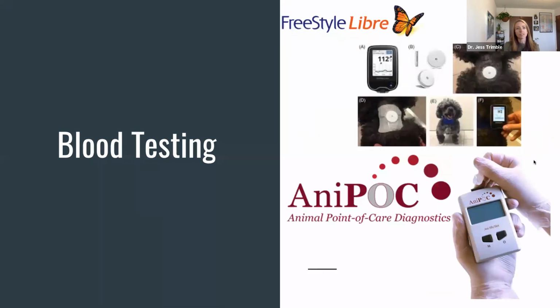A little bit more on blood testing, more on the specific side. If you haven't heard about the Freestyle Libres being used in dogs, they're awesome. This is a human thing that's been translated into dogs. They've tried to use it on cats, but as usual, cats are difficult for everything. And so it's worked not with quite as spectacularly good results as with the dog.